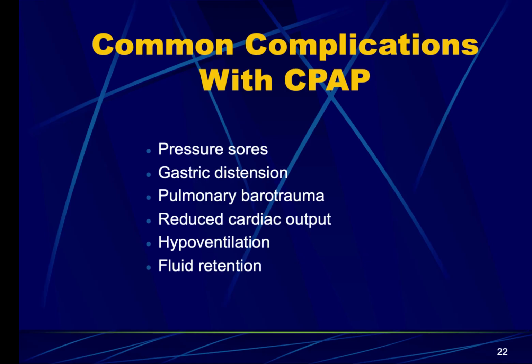Guys, when we're talking about common complications with CPAP, I'm not going to go too much into this. I think your respiratory guidelines lay out the protocols that we want you guys to follow when it comes to actually using the CPAP. But I am going to talk about a couple things. First off, we want to start low on our PEEP and work our way up.